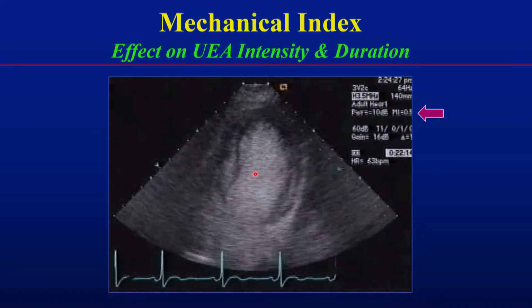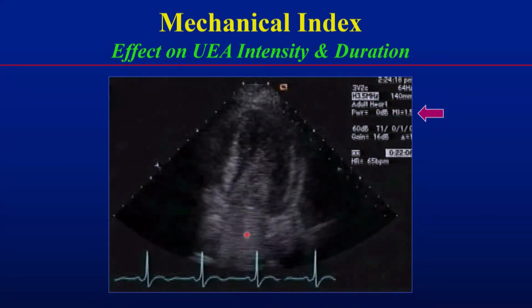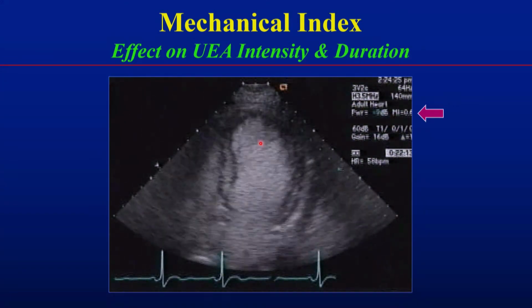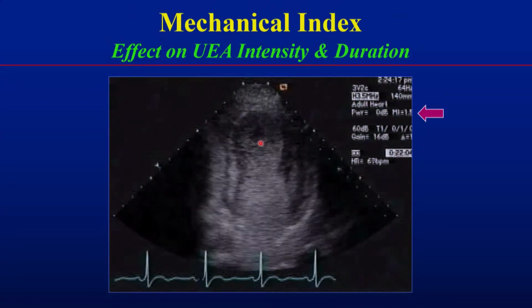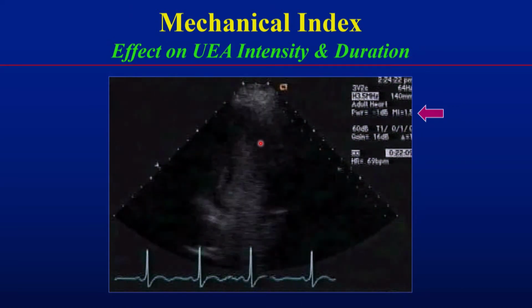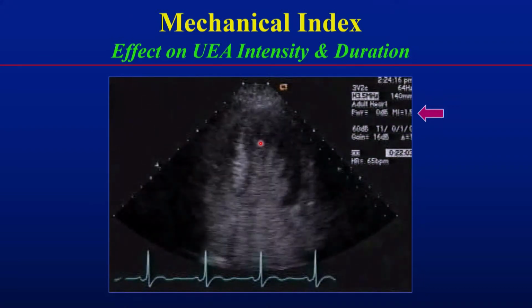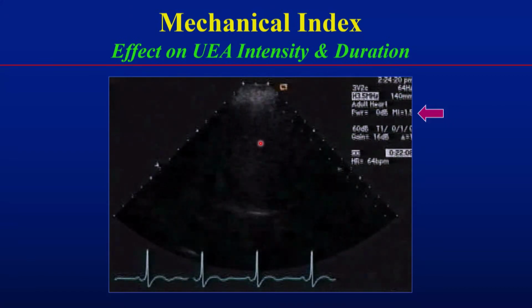And the way you suspect it is I have a decent injection, a decent opacification of contrast here, yet in the apex, it looks like almost like a hurricane. It is a mixture of contrast and no contrast, and you'll see it there. Interestingly enough, I'm showing you a case here of a normal heart. At times, if I have an apical infarct by itself, and I decrease the mechanical index way down to 0.2, I may still see this hurricane phenomenon.